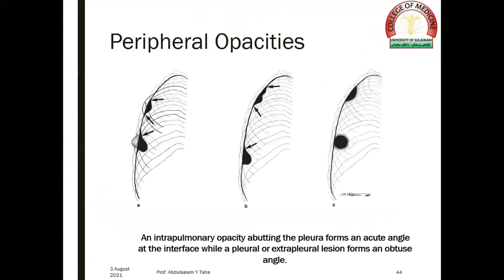Peripheral opacities: when you have an opacity in the periphery of the lung, it might be intrapulmonary, pleural, or extrapleural. If the angle between the peripheral opacity and the chest wall is an acute angle, then the opacity is intrapulmonary. If the angle is obtuse, then the lesion is pleural or extrapleural. An intrapulmonary opacity abutting the pleura forms an acute angle at the interface, while a pleural or extrapleural lesion forms an obtuse angle.